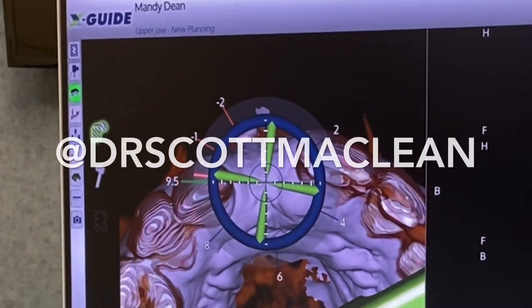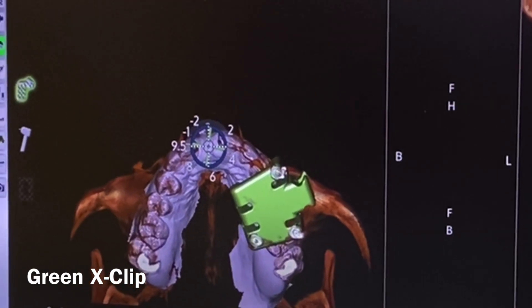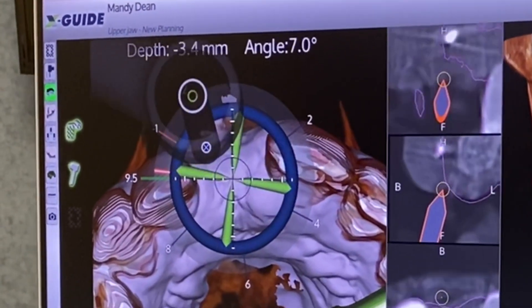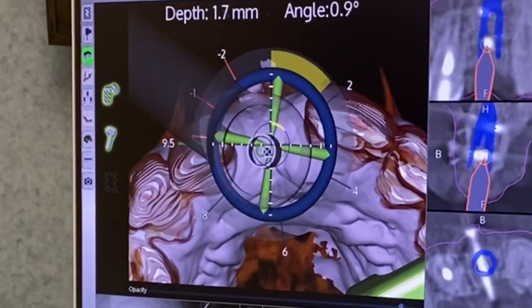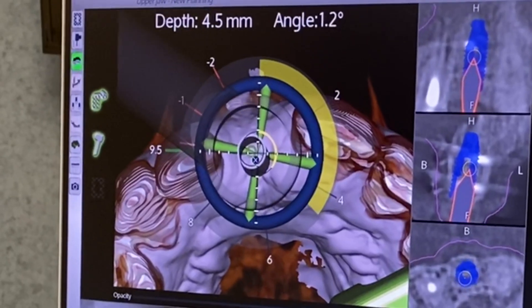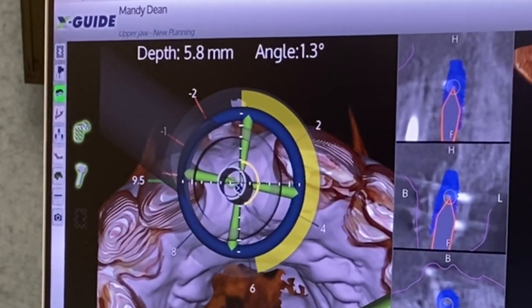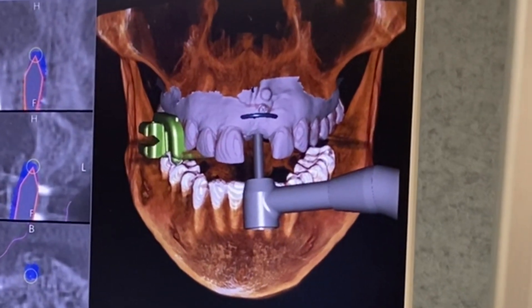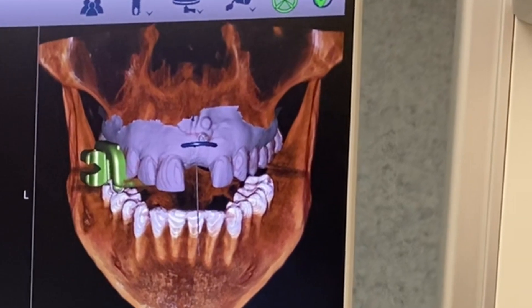We'll do this on a number of drills to get the osteotomy widened, and we'll also use the implant to put a little bit of pressure here. You can see the blue implant on the right-hand side — you can actually see the model that I've planned in DTX Studio implant, and it's not going to hit the bone screw. Those have been taken out, but you can see we're tracking the exact position as we go down inside, staying at an angle of about 1.2 to 1.4 degrees, which is very minimal movement. As we go in, we can follow the implant placement to get the right depth and angulation with this system.